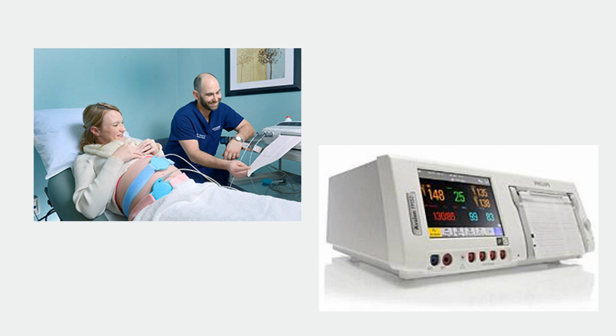Typically, if they're over 25 weeks, we might put the fetal monitor on, but just be aware that we're not really able to interpret with accuracy some of the information unless they're at least 28 weeks gestation. Then we start to be able to interpret, okay, this is what's going on with the baby. Because the fetus doesn't have the neurological maturity to produce certain components, that's why we don't really interpret what we're seeing until they reach that 28 weeks.